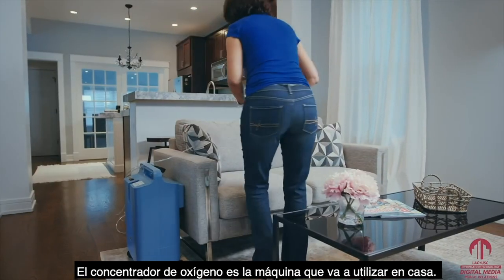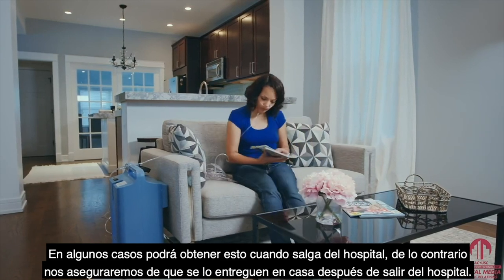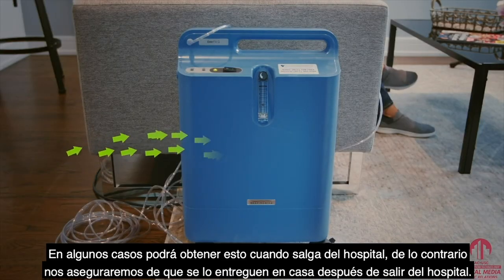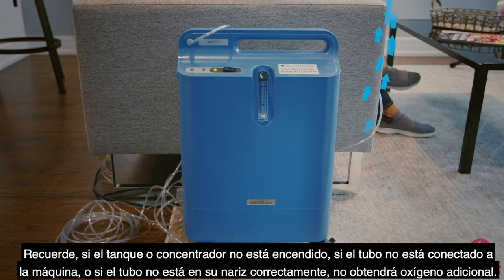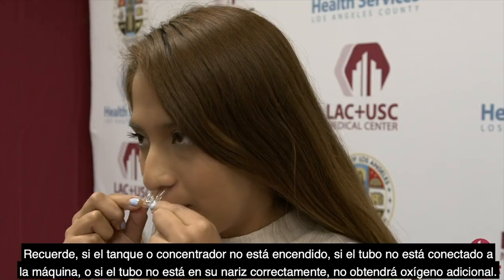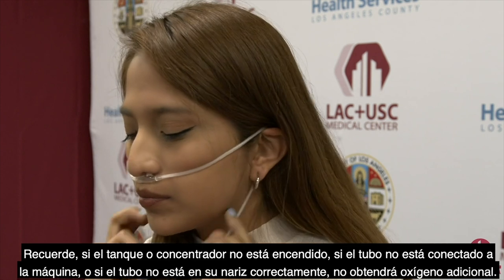The oxygen concentrator is the machine you will be using at home. In some cases you might get this when you leave our hospital, but otherwise we will make sure it is delivered to your home after leaving the hospital. Remember: if the tank or concentrator isn't on, if the tubing is not connected to the machine, or if the tubing is not in your nose correctly, you will not get any extra oxygen.